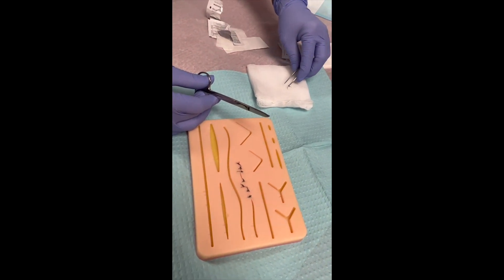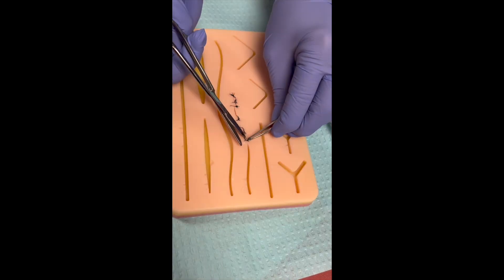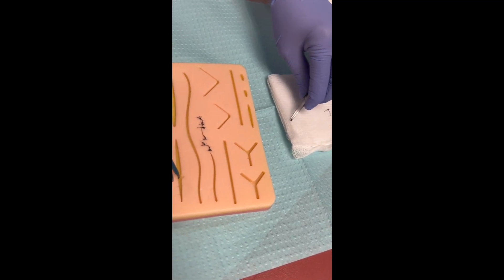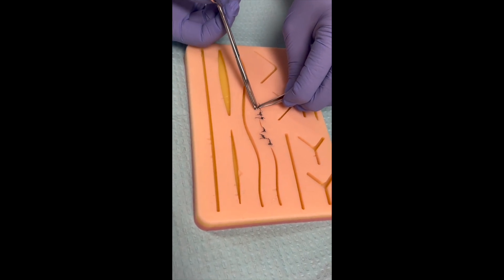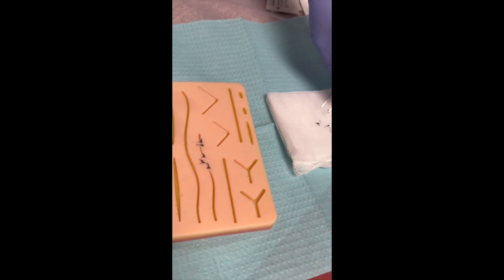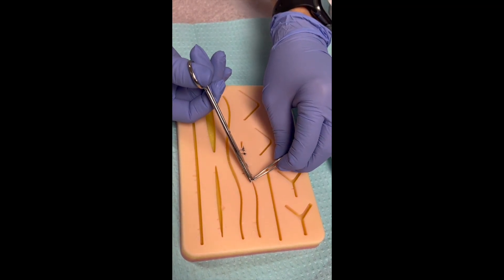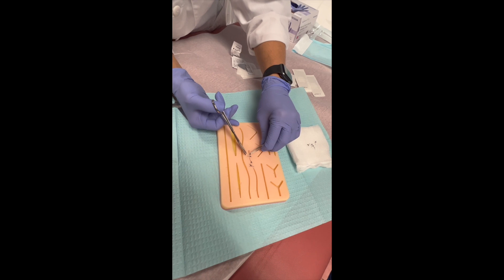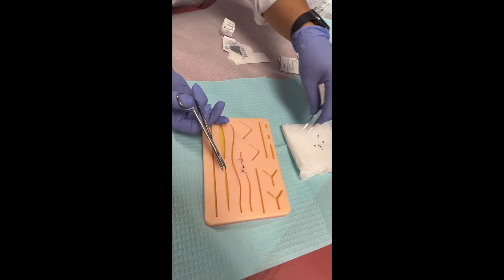As I take them out, I keep them next to me for documentation purposes. We rotate from one to another. Sometimes sutures will be a little harder to cut — if you have scabbing over them, you can apply a little warm water to let it soak and then proceed. The reason we start from the middle and rotate is that if the area didn't heal well, we want to stop, confirm with the provider, and then go from there.